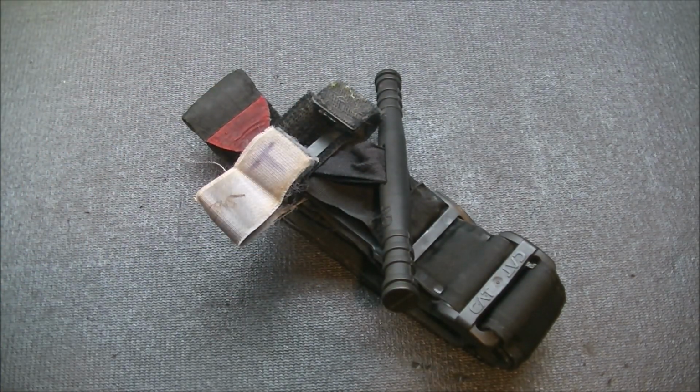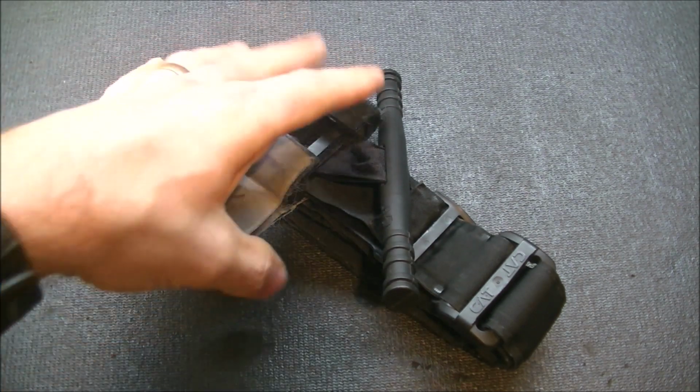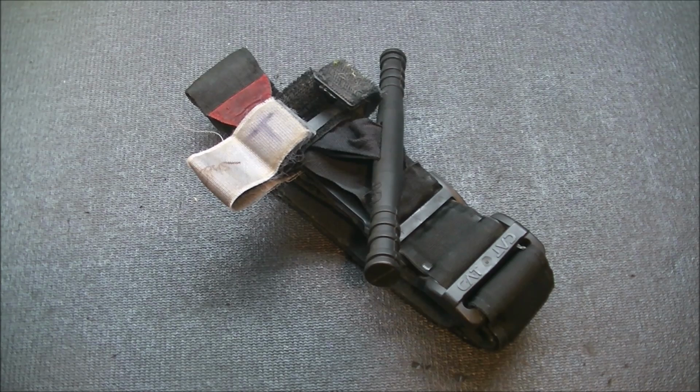But anyways, let's start with the pros of the CAT tourniquet. Number one, it's very easy to use one-handed. It also has no metal on it, so you're not going to have to worry about jingling or anything like that. And there are a lot of carriers for these things. So if you want a tourniquet and you want to find aftermarket carriers, like different pouches or whatever, then the CAT tourniquet is the way to go. It's also heavily used universally. Almost every training class you go to, anybody that's even talking about the use of a tourniquet, the CAT is probably the number one tourniquet being used by them.